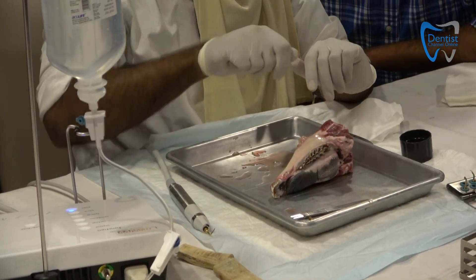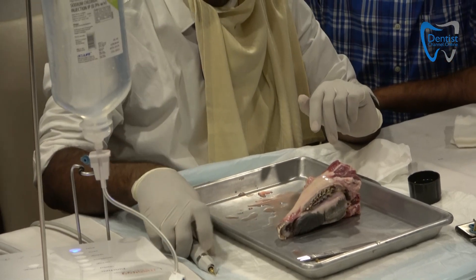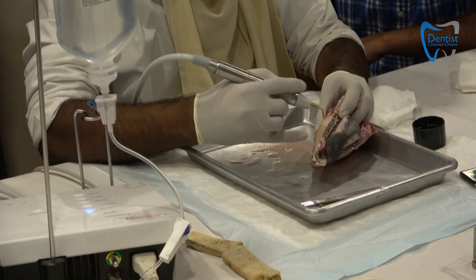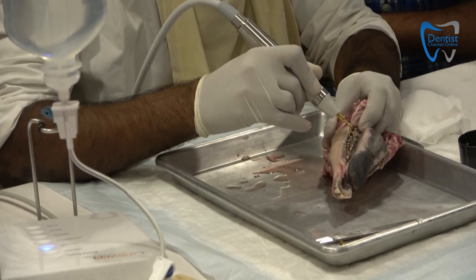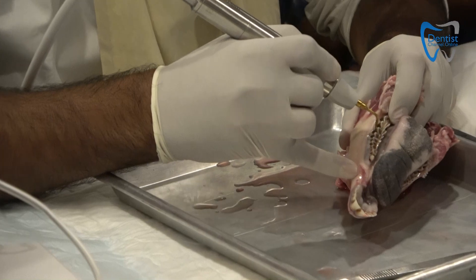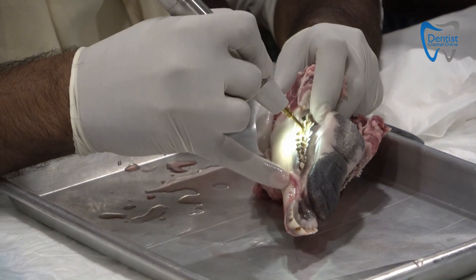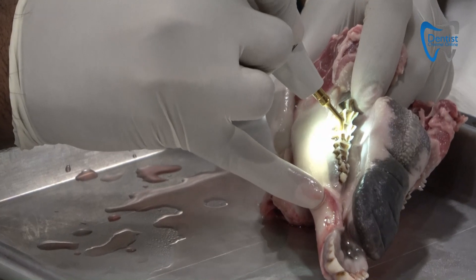You have to insert it manually, just go in manually and do it. Here we'll keep it on the cortical setting. For example, if I'm trying to extract this tooth — it's the foot control there. I'll just take a support and start. Can you see that my instrument is going around from inside?